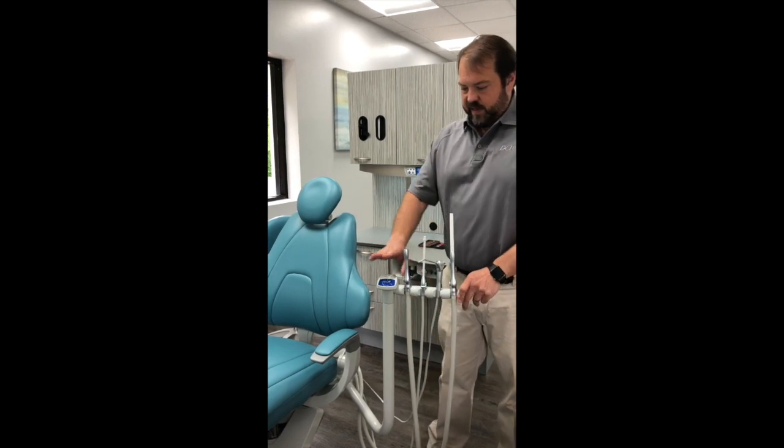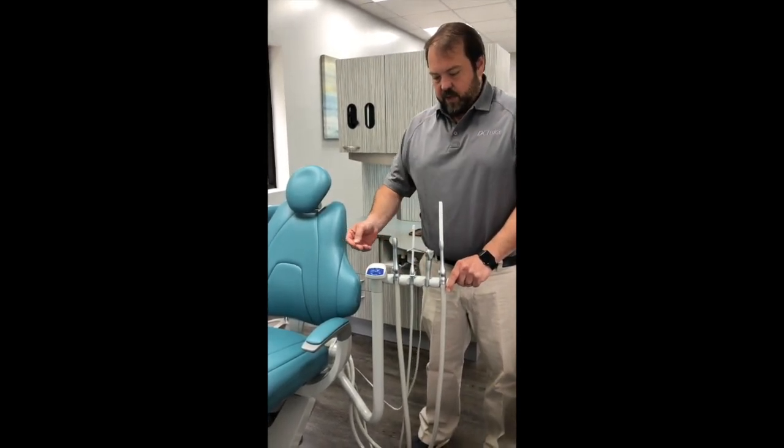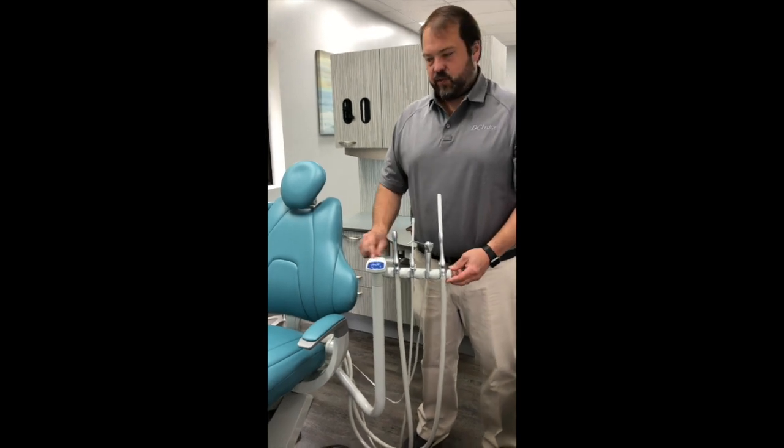This is the DCI Edge Series 5 system for assistance instrumentation. Pretty basic — it's very similar to our dental unit.